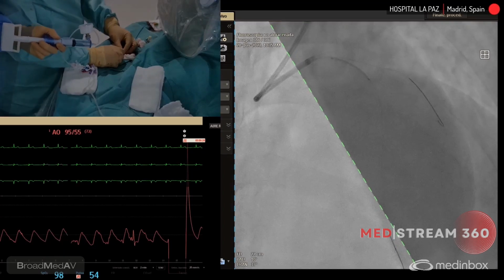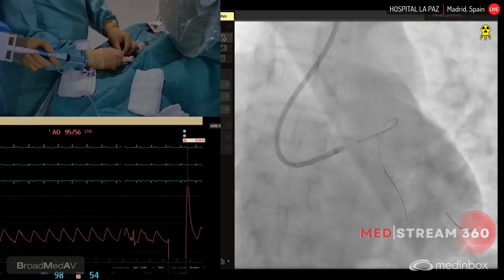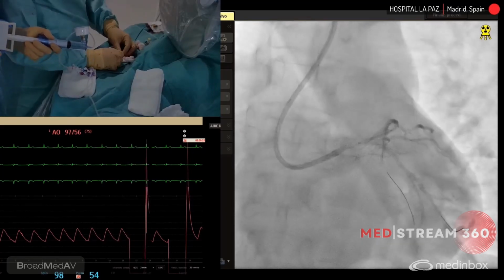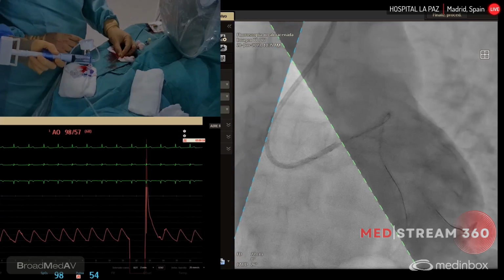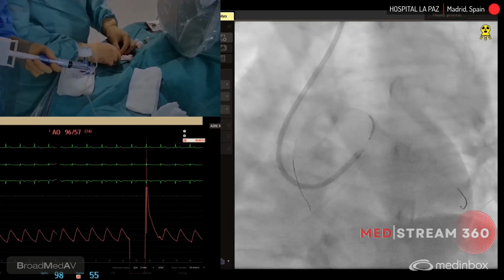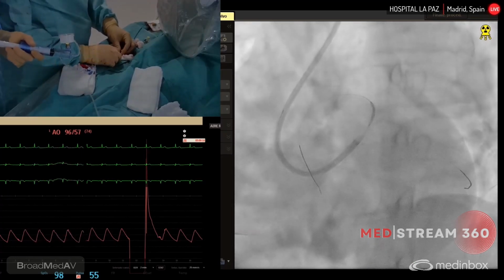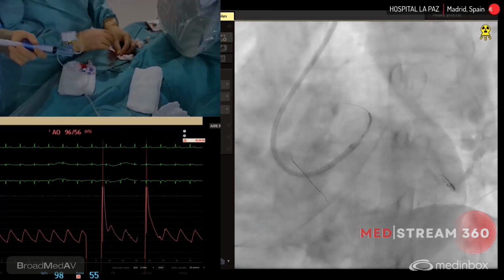A little bit more forward. Let's make a cine, and okay, we continue there. I think it's a good position, no? Okay, let's go. Yes. I'm going to nominal, that is 11. Because this is the distal plaque part, 11. With expansion, okay, down.